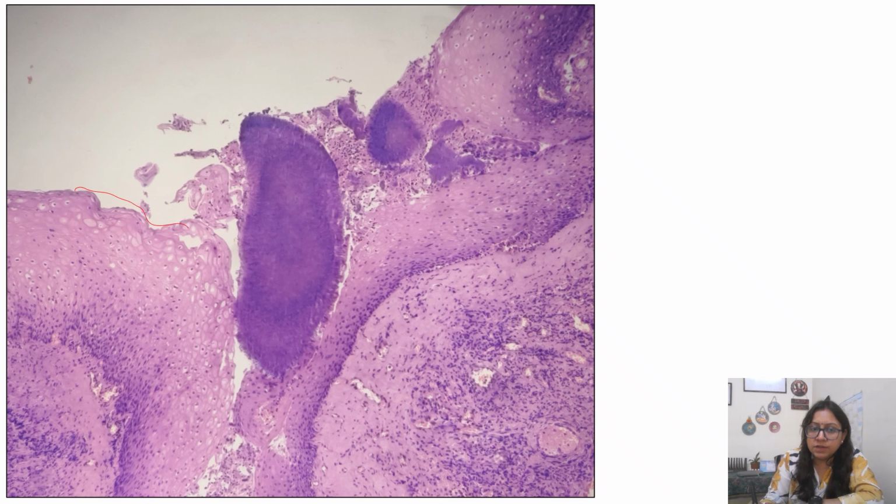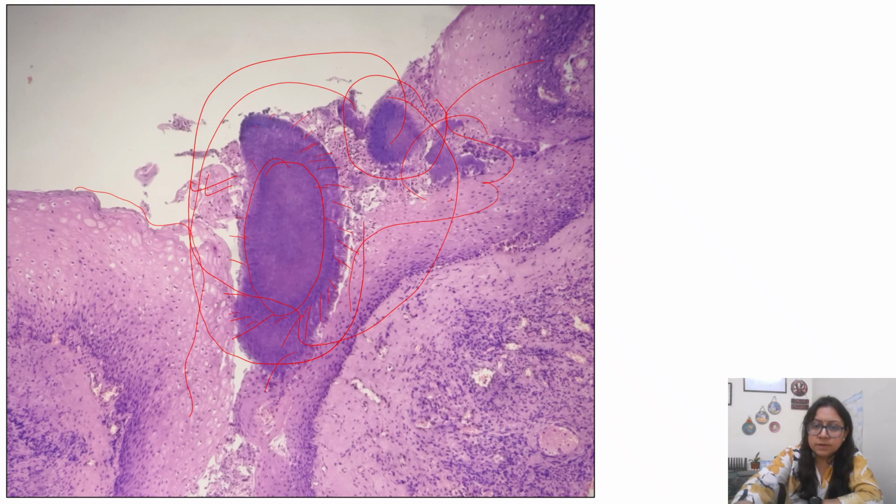We are seeing the stratified squamous epithelium, and this is our area of interest. These are actinomycosis: one ball you are seeing here, one here, the big one, and the small one here. In the periphery you can see a radiating architecture. These are basically filamentous organisms, in between you have your sulfur granules, and this is the periphery where the immunological reaction and cell debris are getting accumulated.